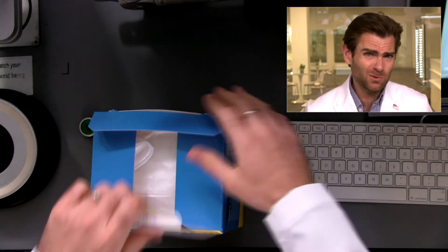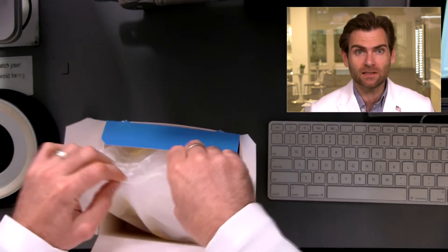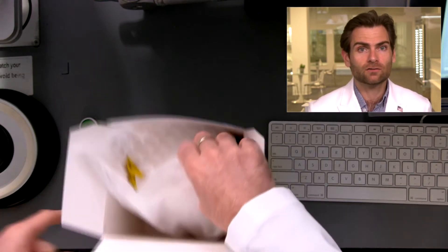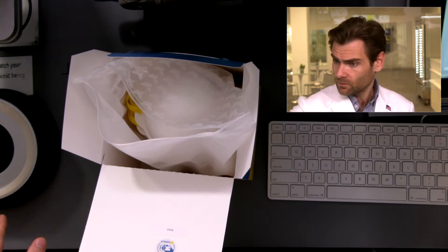Hey everyone, welcome back to the place where we test every single mask in the world. Today we are testing the Aegle N95 cup respirator. This thing is new on the market — they launched right before Delta. They've got a great product and a great box. We'll talk more about that, but let's get it in the clamper so we have a reason to talk so much.